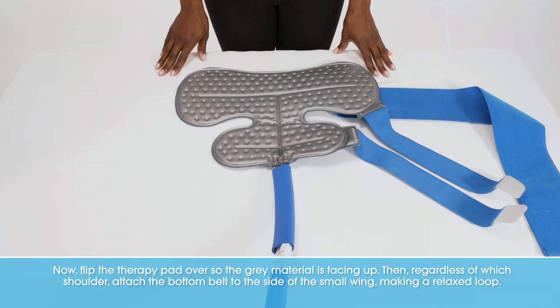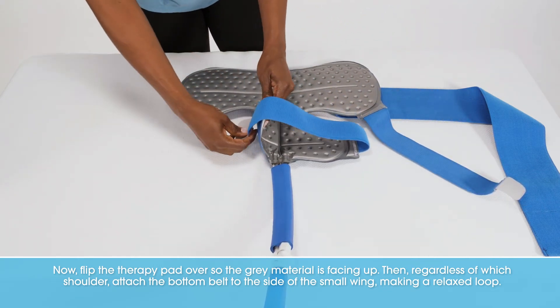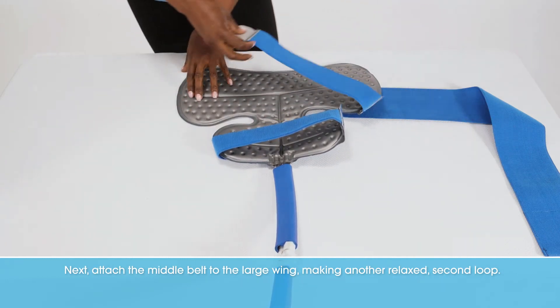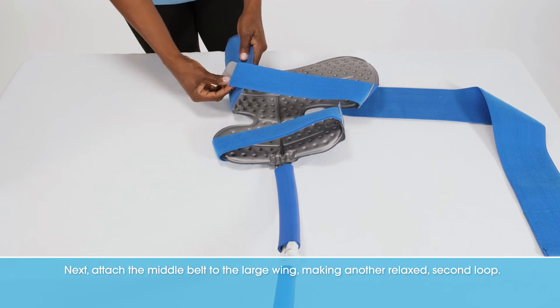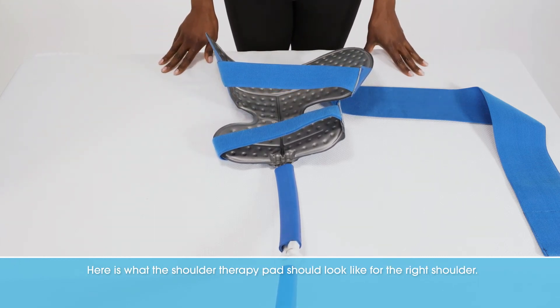Now flip the therapy pad over so the gray material is facing up. Then, regardless of which shoulder, attach the bottom belt to the side of the small wing, making a relaxed loop. Next, attach the middle belt to the large wing, making another relaxed second loop.